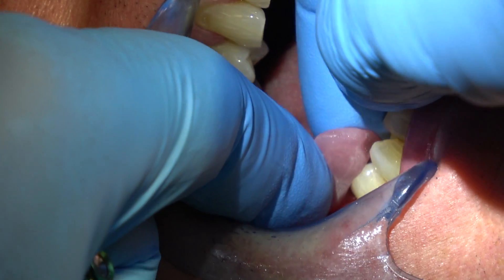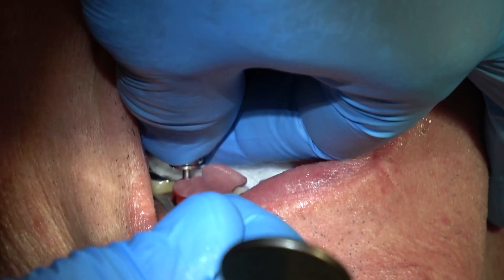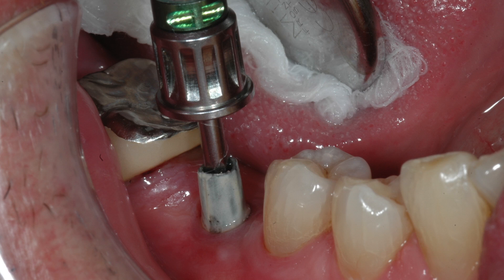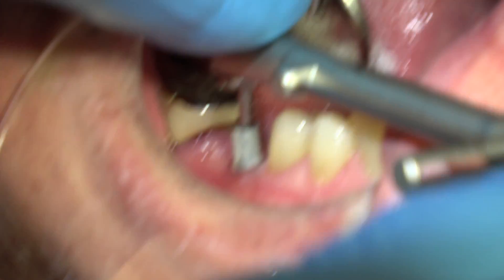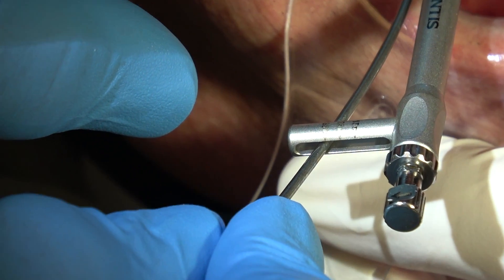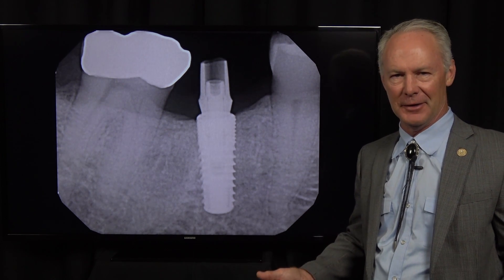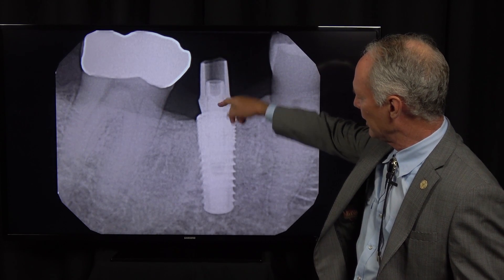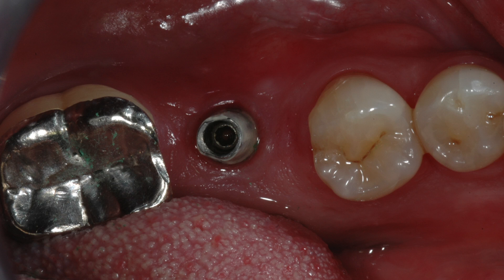You fit this part on the adjacent teeth. I love doing implants. Then you're going to screw it in — which way? Righty-tighty, clockwise to screw it in. I'm going to screw this abutment into the implant at 35 newton centimeters. And see, here's 35 newton centimeters — that's the perfect tightness. Implants are kind of like a heart transplant: they're very easy if you know how to do them, just follow the steps. This is a radiograph to confirm that the implant abutment is properly seated. Look at that alveolar crest — doesn't that look great? That's after three months of implant placement. There's the implant abutment.